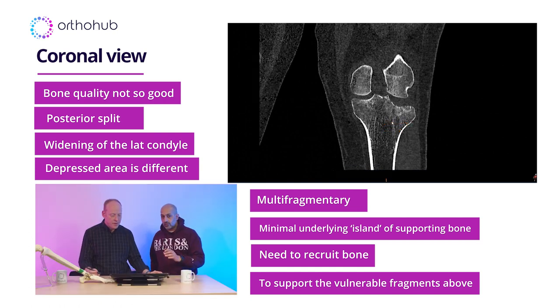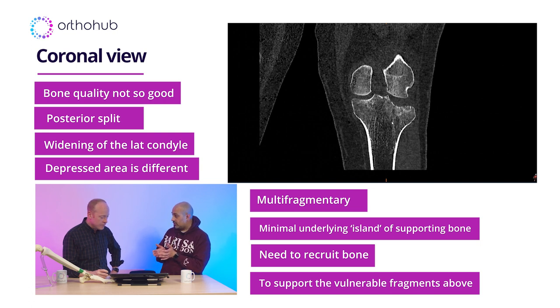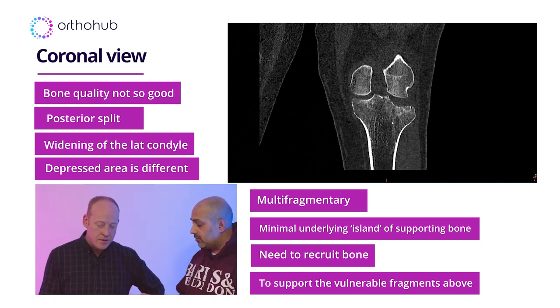And we're going to go into that in more detail in some of the further videos that we do about the surgical fixation. Yeah. But in order to get the information that you're talking about, then the question that comes to my mind is, is there an access point? Is there a front door? And so we need to see some of the other views to see that.